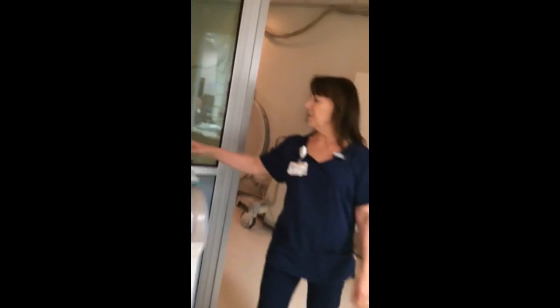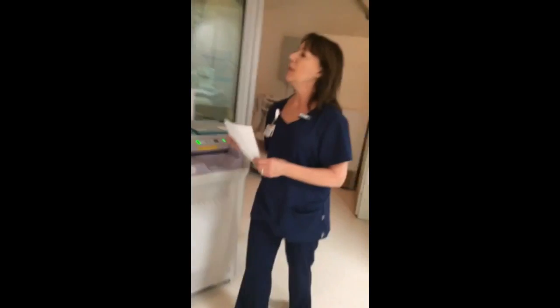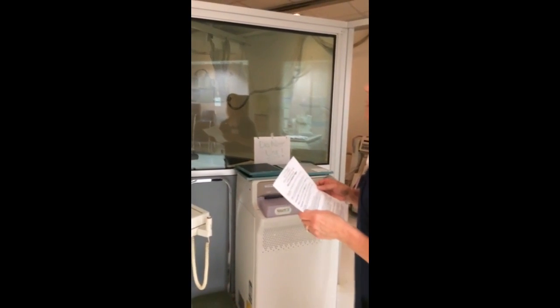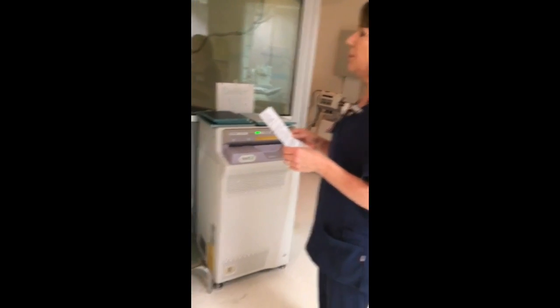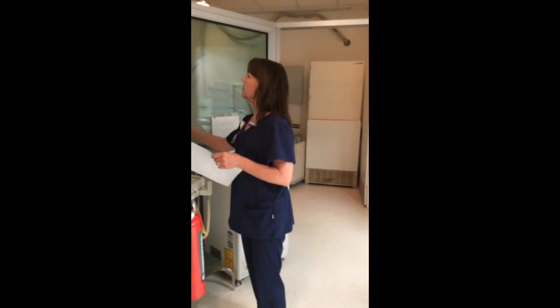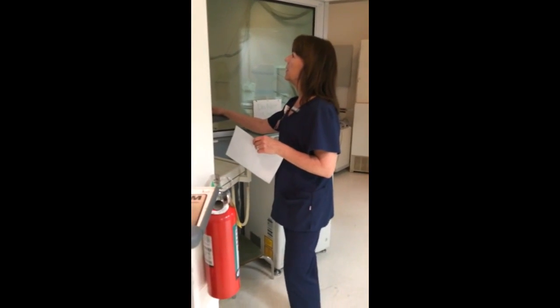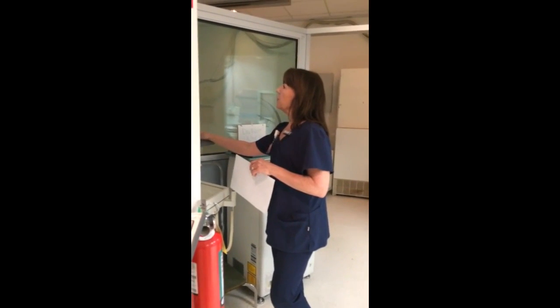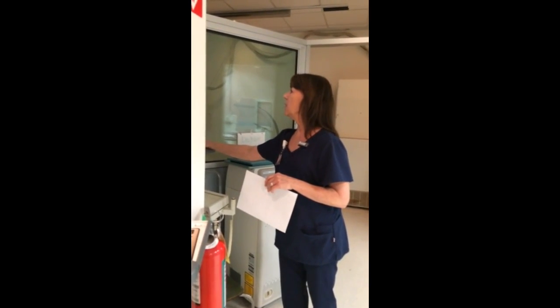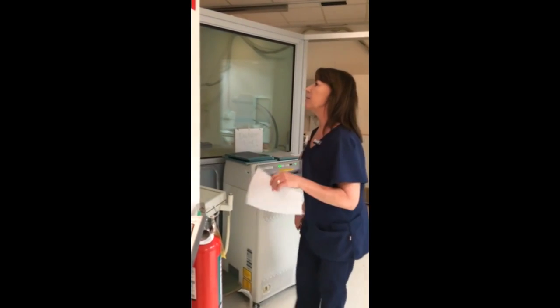I'm going to get my requisition. I'm going to verify the information with the doctor in the computer, and I'm going to enter my patient's last and first name, date of birth, and my patient's gender. My technique for my patient today is going to be 70 kV with a 5 mAs for my AP view. I'm going to enter the views that I'm doing, which will be an AP oblique with internal rotation, a lateral, a tunnel, and a sunrise. So I'm ready to get my patient.